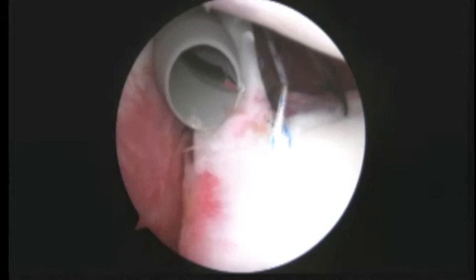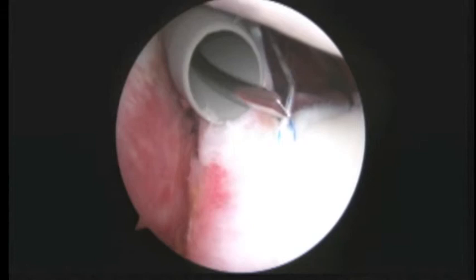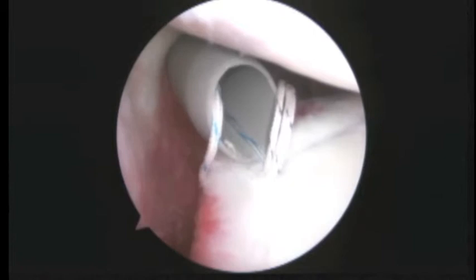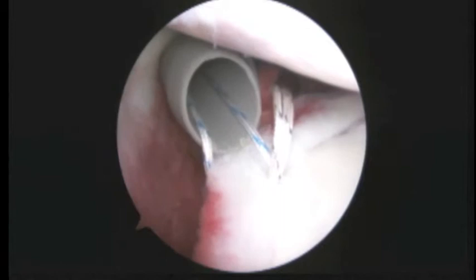Here we have things organized to start to repair the SLAP. We'll pull back and then push forward just like that. I'll show you some more in just a minute. We've got our first blue and white suture looped around.